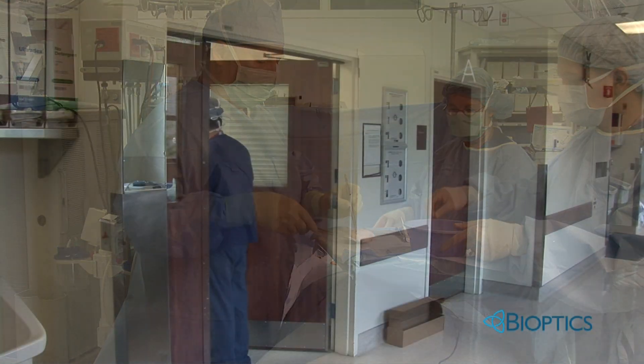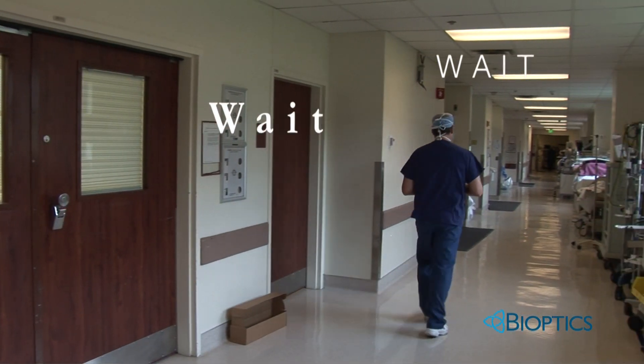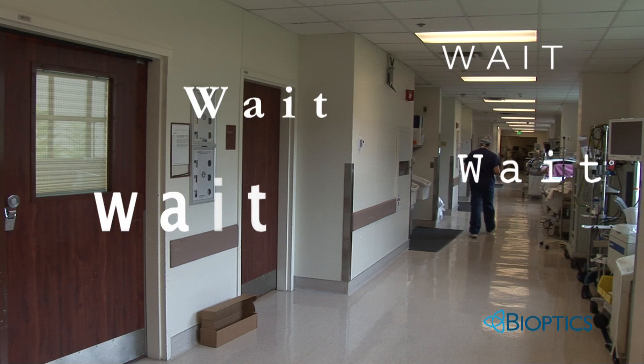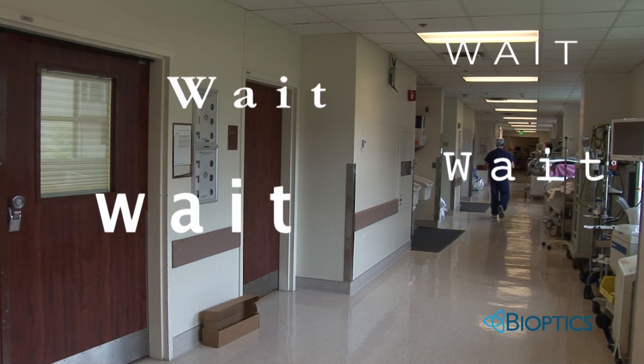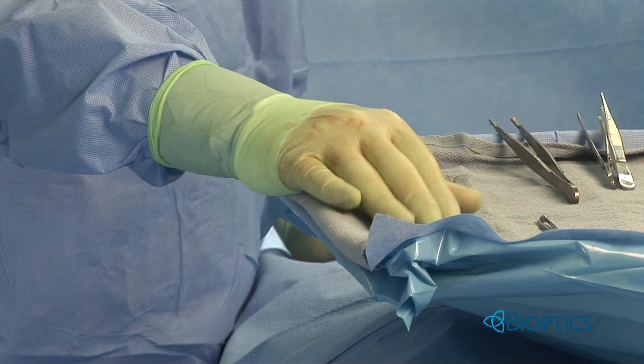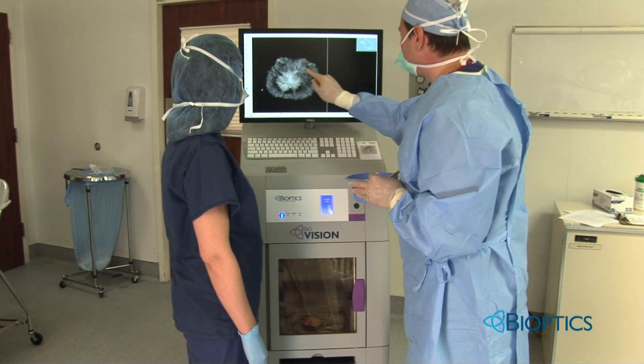Excise the tumor, wait for a courier, wait for the specimen to get to radiology, wait for an available mammography room, wait for the radiologist's reading, finally courier the specimen to pathology and wait for the frozen. It's a time-consuming merry-go-round — a merry-go-round that can be easily avoided with Bioptics BioVision.